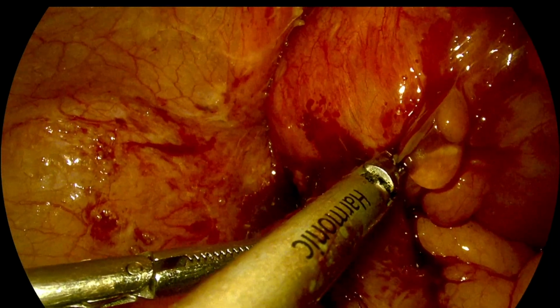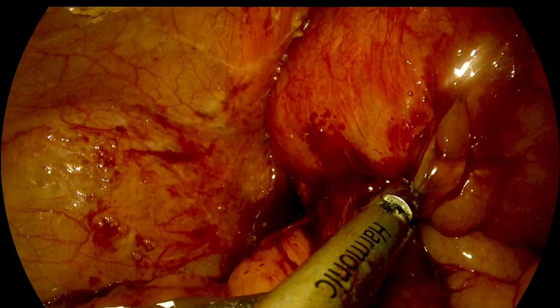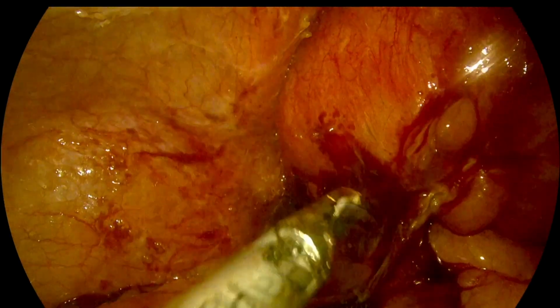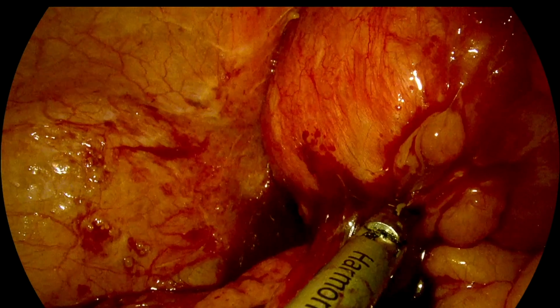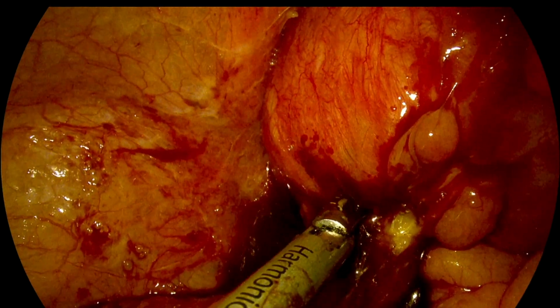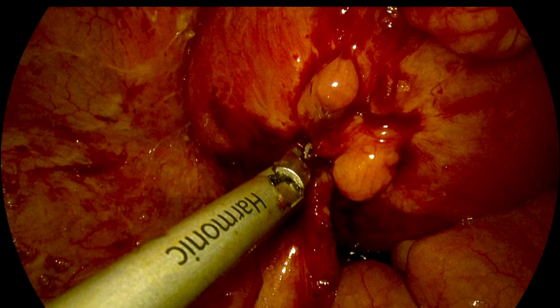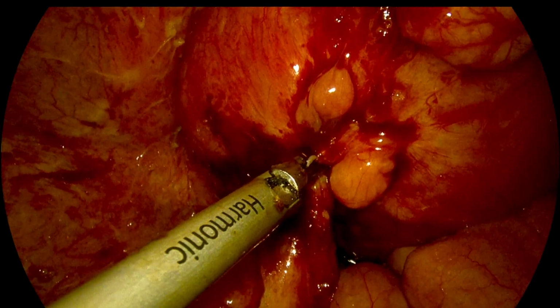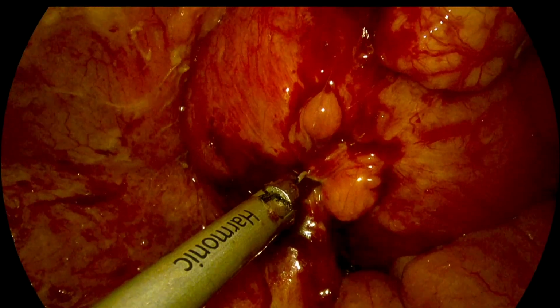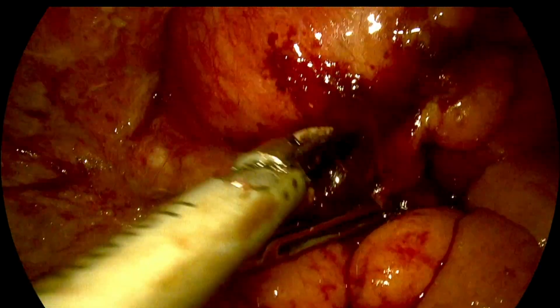So always reconstruct the anatomy before starting the surgery. Identify the structures like the round ligament, the infundibulopelvic ligament, and the uterovesical fold of peritoneum. This anatomy needs to be identified and reconstructed as much as possible before we start dividing the pedicles.